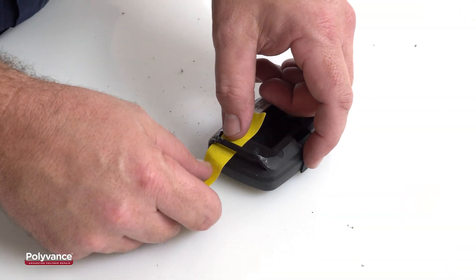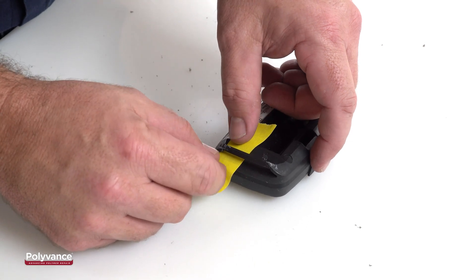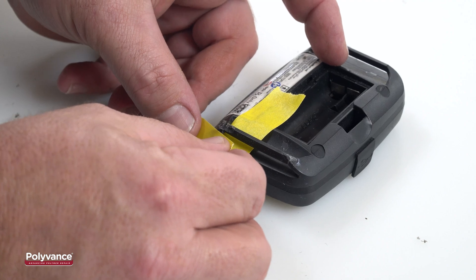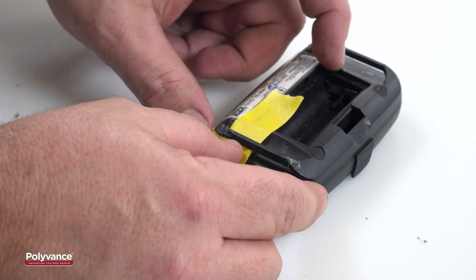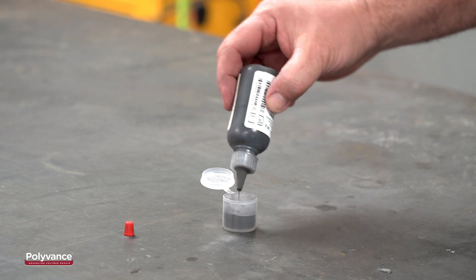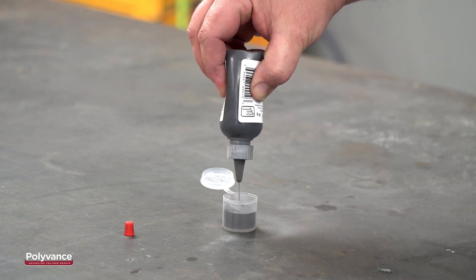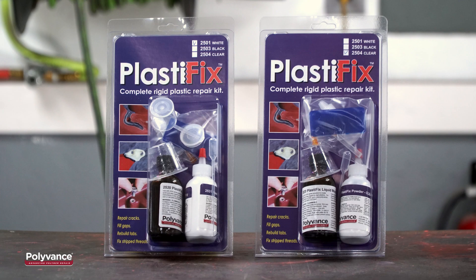Mask off any areas of the plastic you don't want the adhesive to affect. Like acetone, the liquid component of PlastiFix will soften ABS and leave a mark. For this repair, we are using the black PlastiFix powder found in the 2503 Kit. Polyvance also offers PlastiFix powder in white and clear.